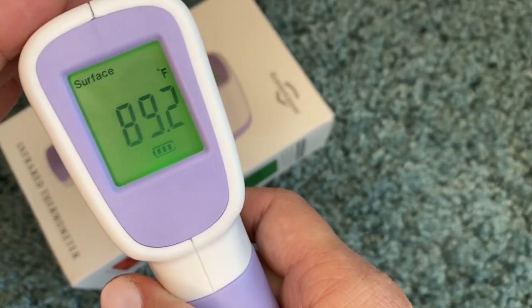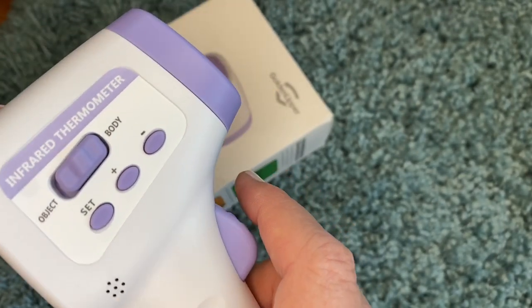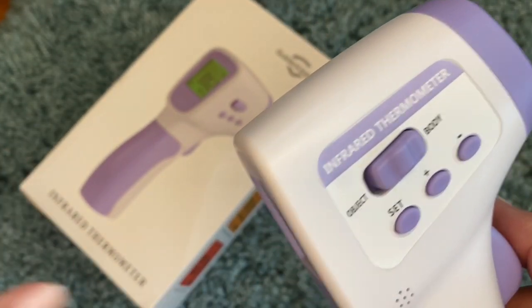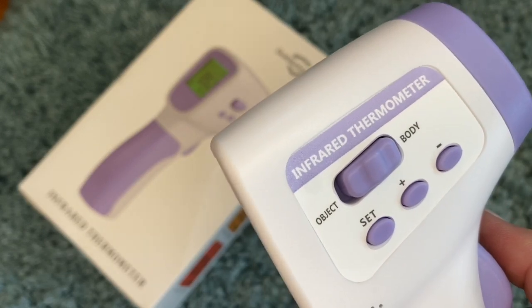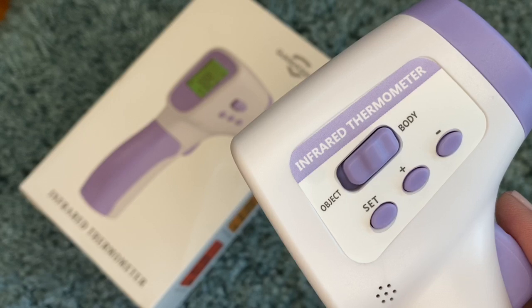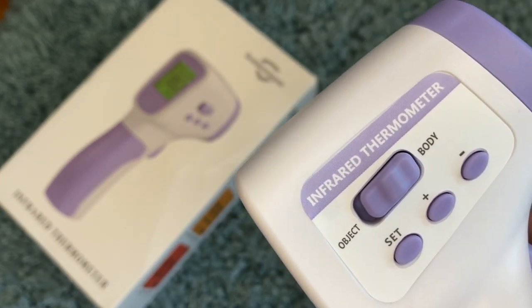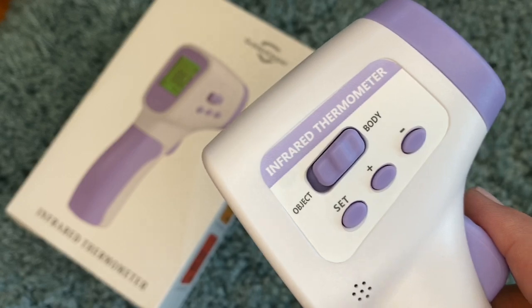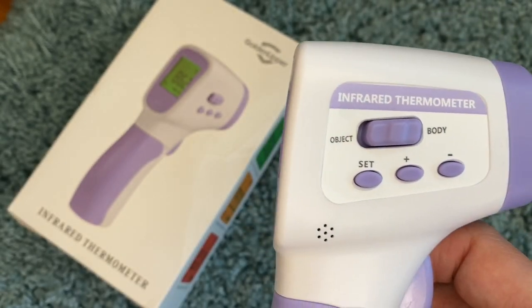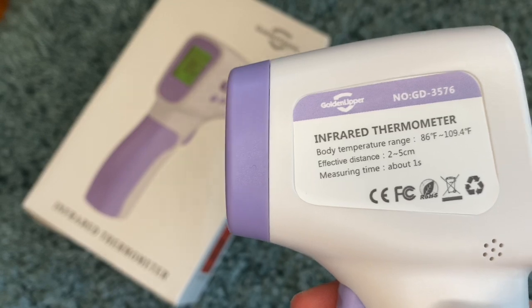You can take temperature of surfaces or body. Everything else seems to be pretty self-explanatory. I really think this is a great deal and a great product. All of the bad reviews are people who couldn't figure out how to switch it. I wanted to do a video because I would have loved to have found one when we first got this. I will include links as to where you can buy it.